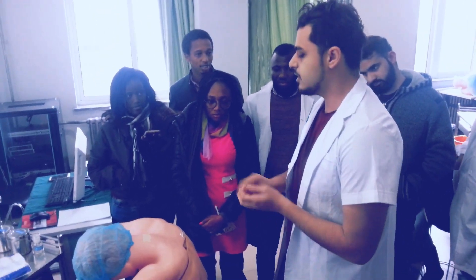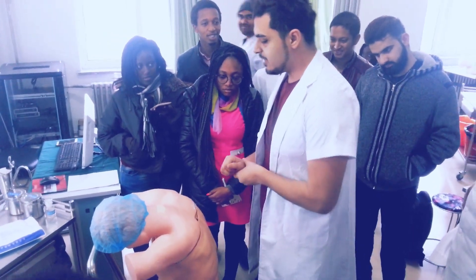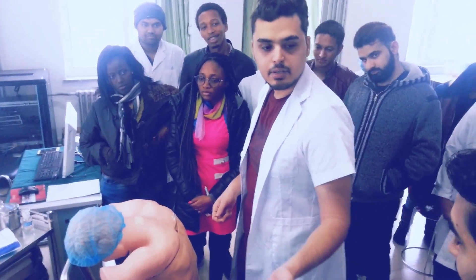This is a very simple procedure, nothing to be afraid of. First of all, we will check CT and do auscultation. By watching, I will ask my assistant to give me the CT.